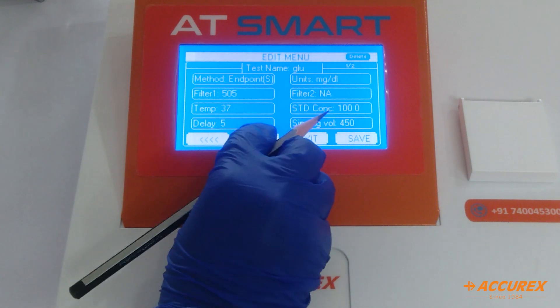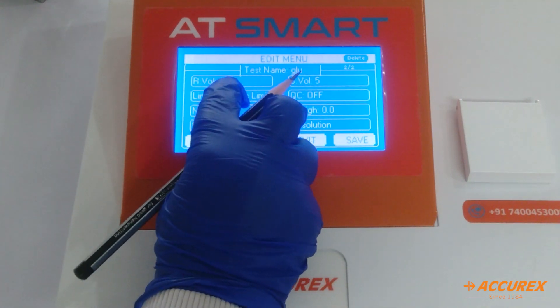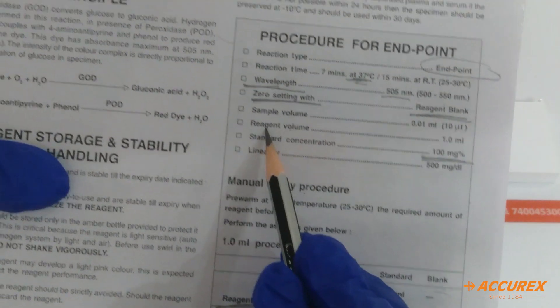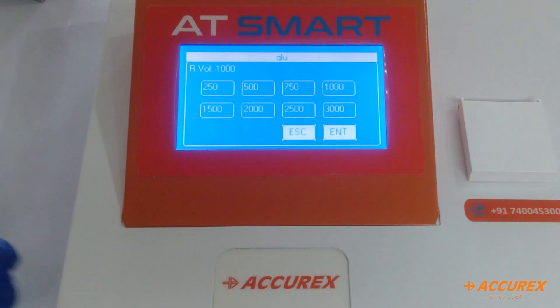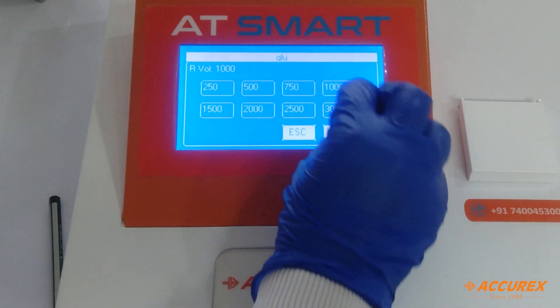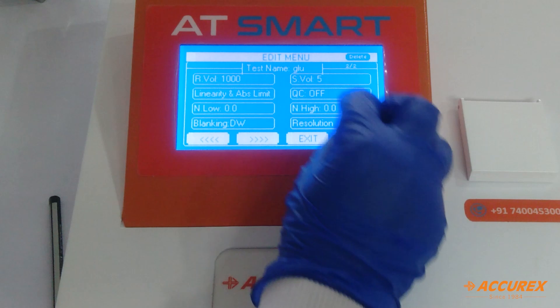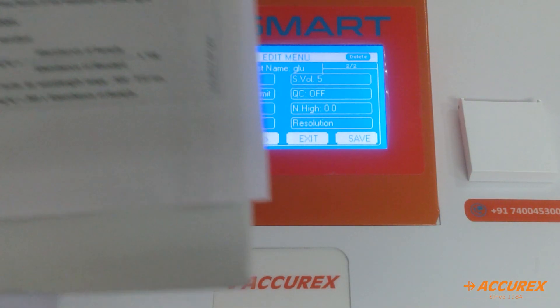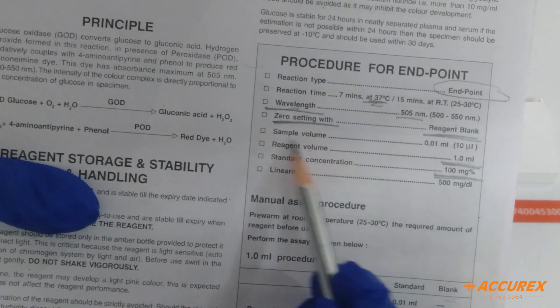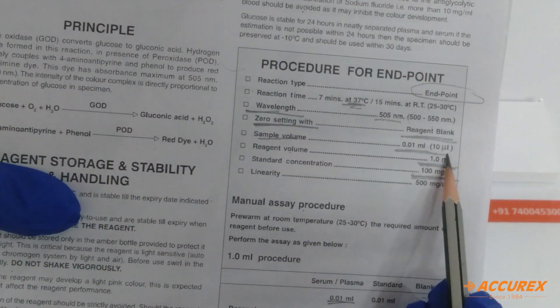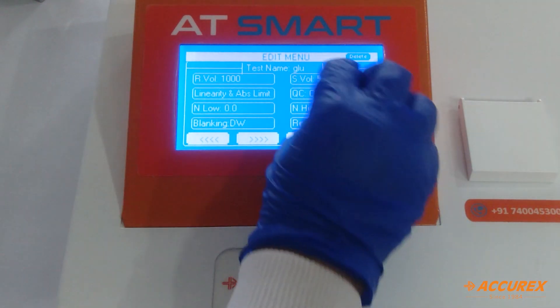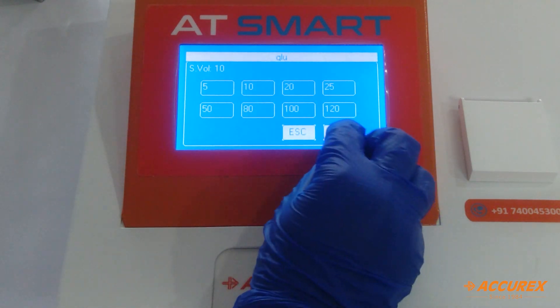Now go to next page. Reagent volume: because we are taking 1 ml reagent volume, press 1000 microlitre and enter. Sample volume: here we have taken 10 microlitre sample, so press 10 and enter.